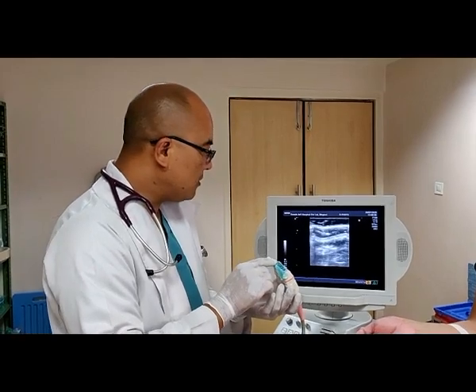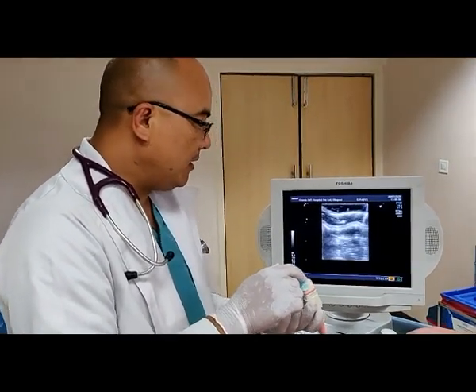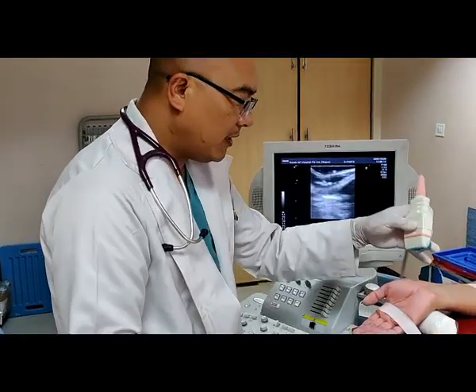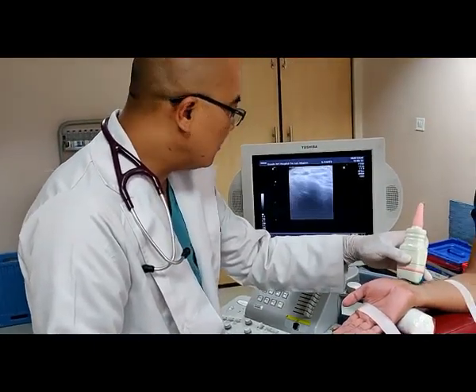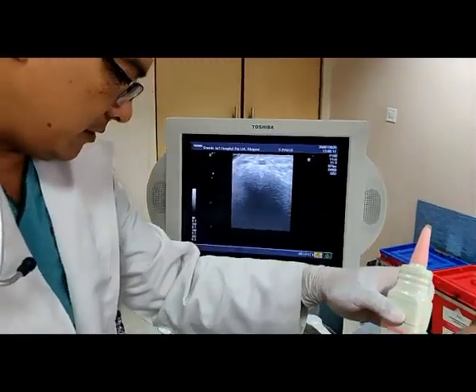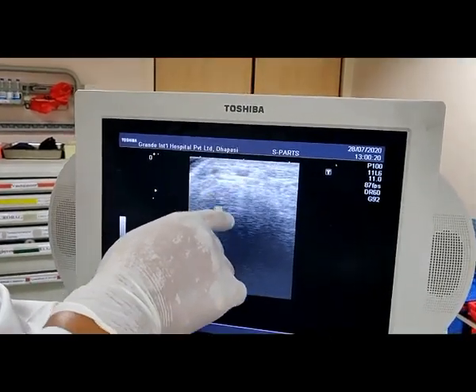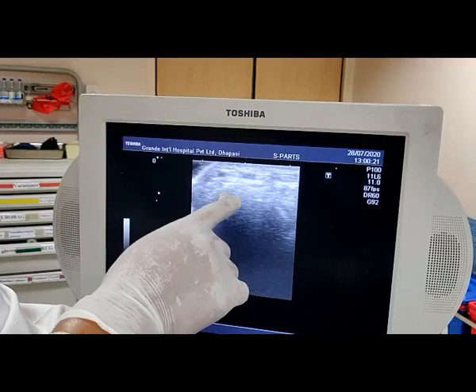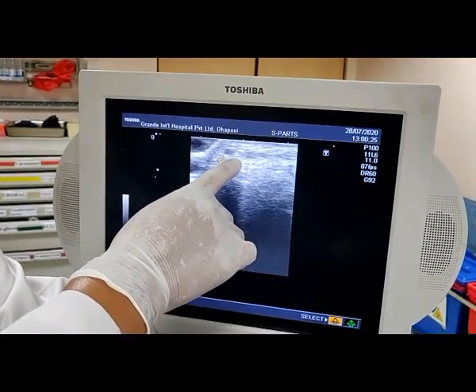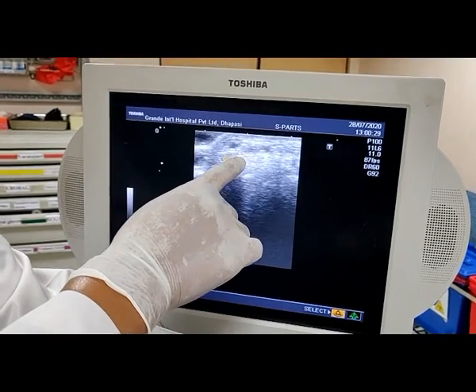This is the right, this is the left orientation. If you look at this, this is the radial artery in transverse view. You can identify it as pulsatile and partially compressible.